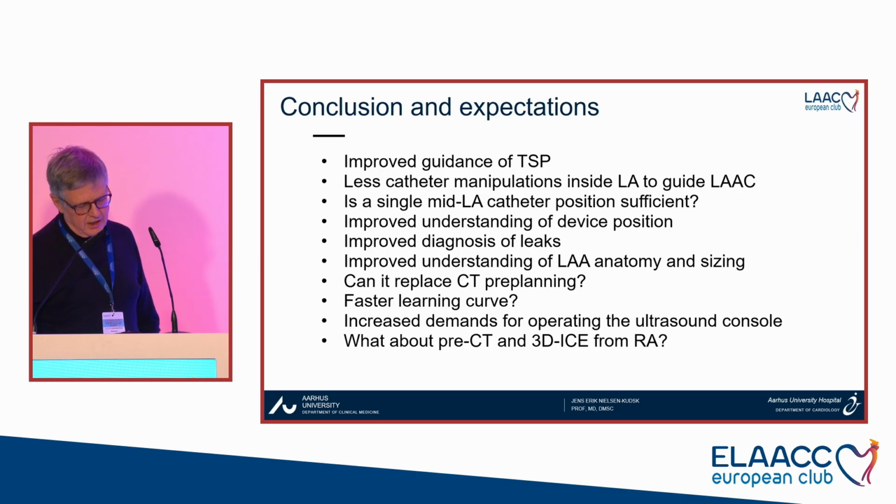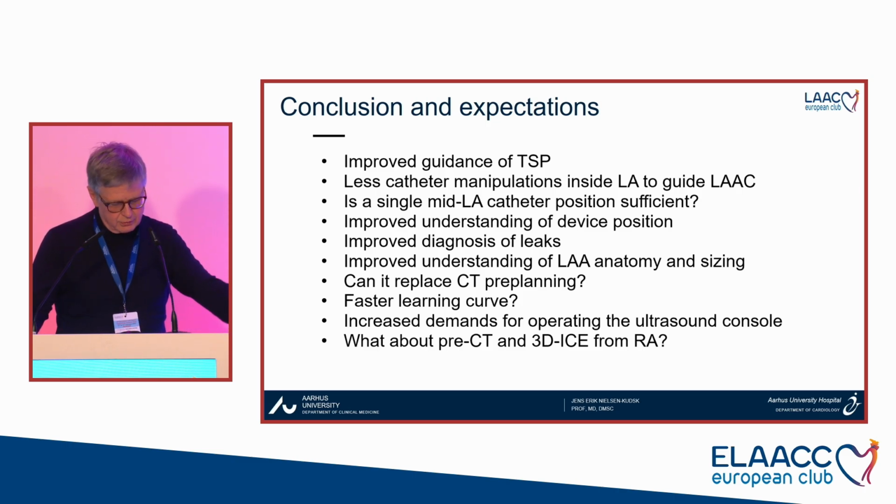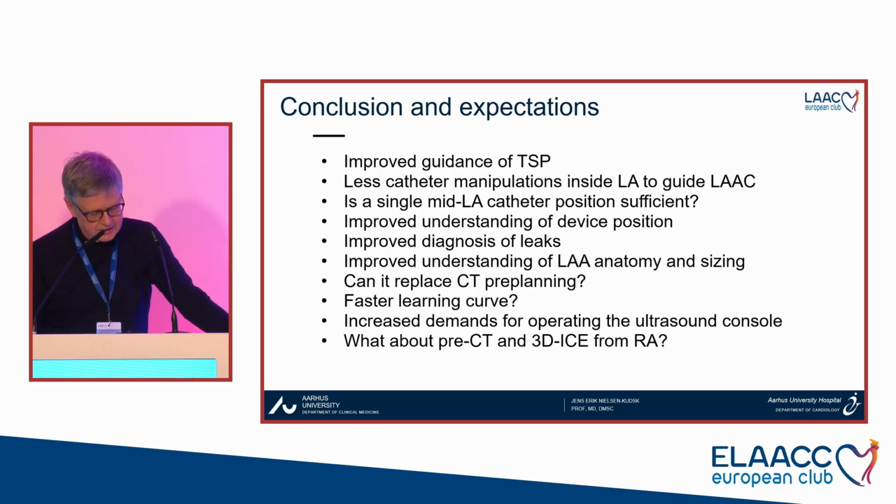So it has the potential to improve the guidance of our transseptal puncture, so that we can have fewer catheter manipulations, that we might have a single position inside the left atrium. We get a better understanding of the device position, as we talked about, aligning the device and the sheath to the axis.